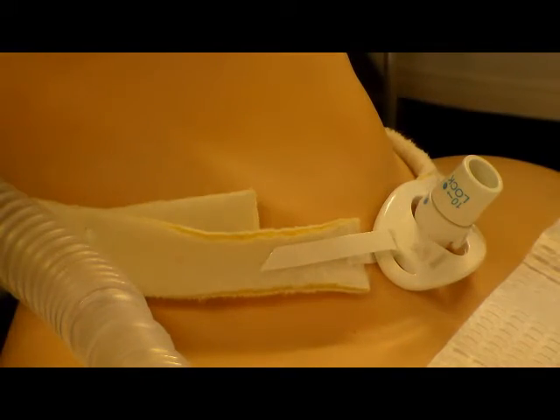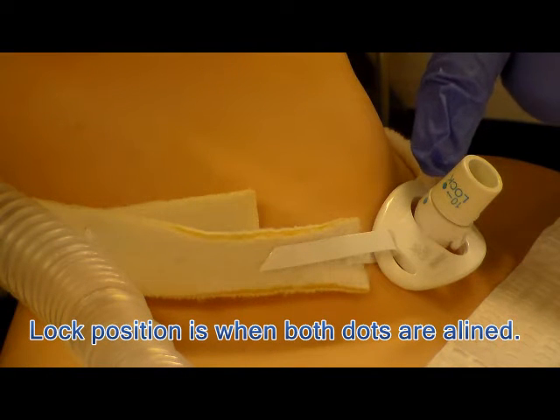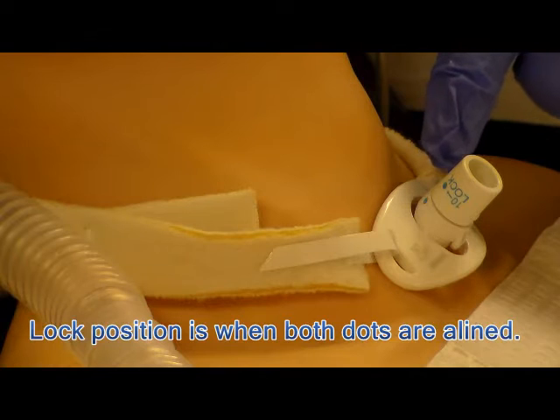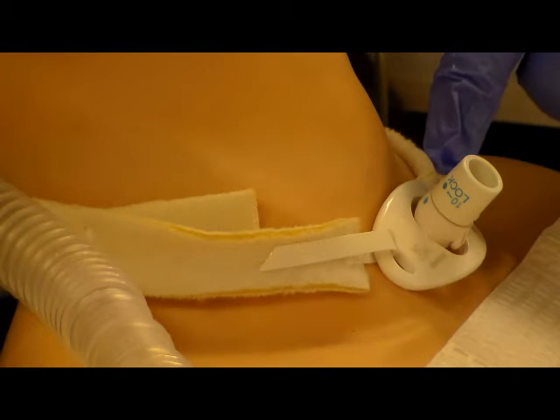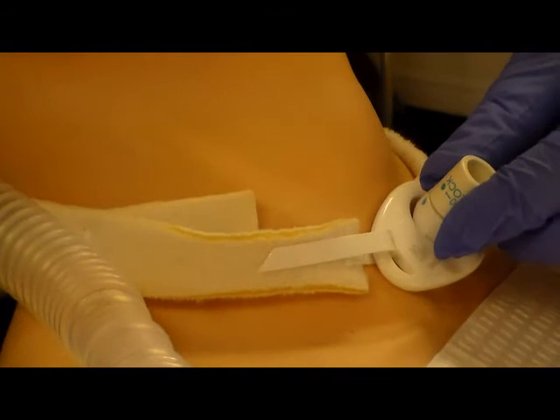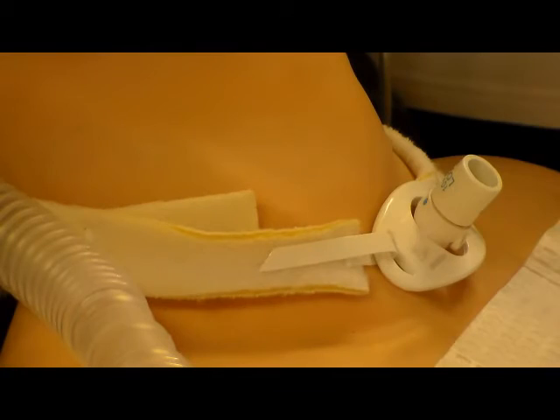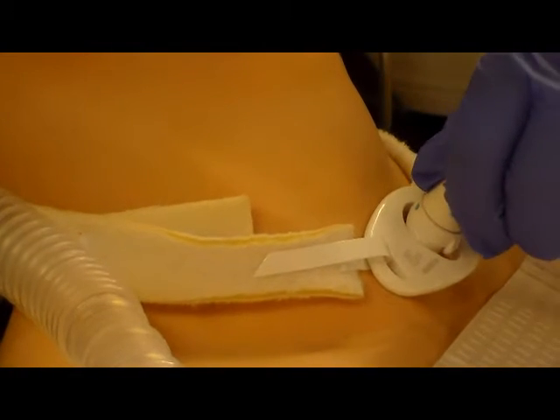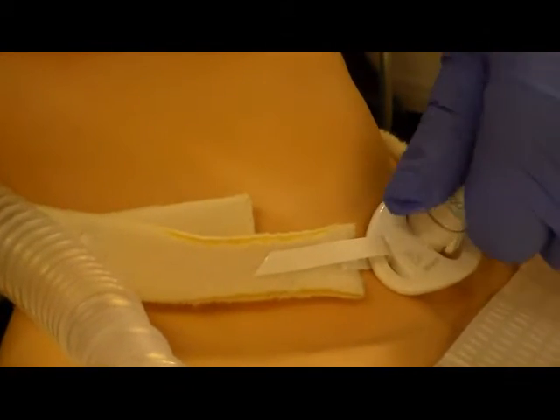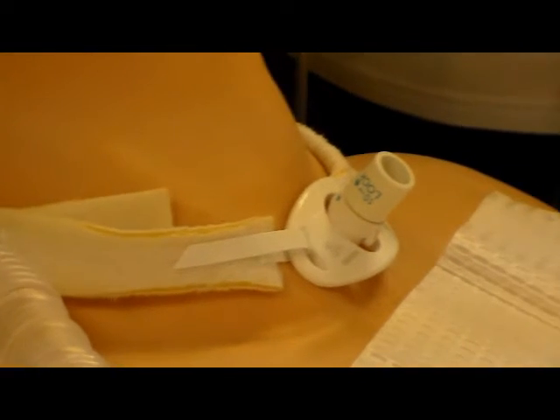Visually double-check to make sure it is in the locked position — you will see the two dots line up, indicating that it is locked. To unlock, just rotate in the opposite direction, then lock back. That prevents the trach inner cannula from coming out.